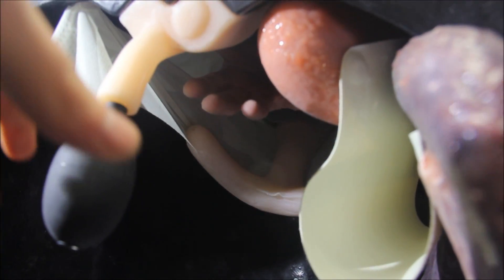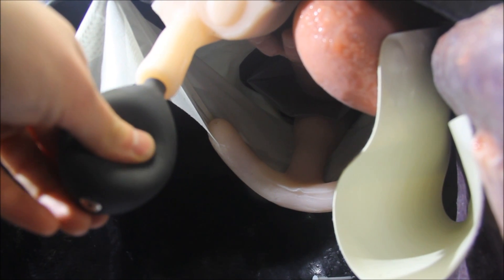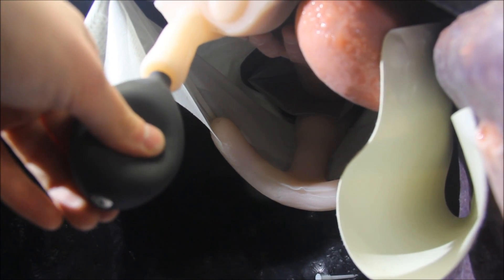A palpable aorta is attached to the dorsal wall of the horse. The pump may be squeezed to simulate a pulse while a student is palpating.